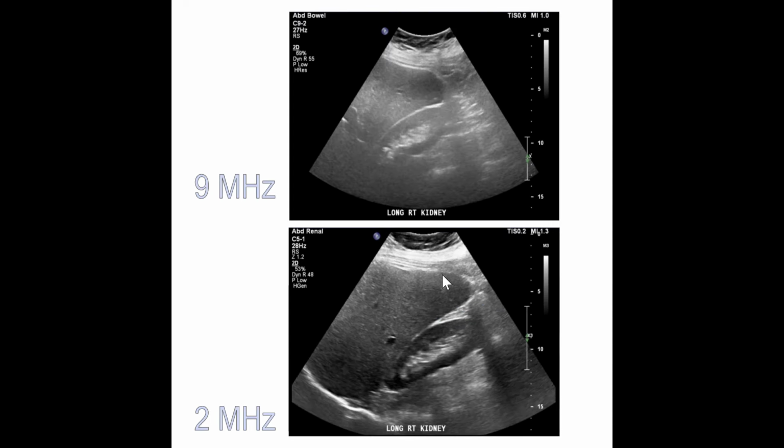In this image here, we have kept the 2 megahertz transducer in the same picture on the bottom, but now we've switched to a little bit lower frequency for the top picture. Now this one gives us a little bit more information. We are imaging to about the same depth, 16 on the top, 17 on the bottom, but this is that attenuation in play here.